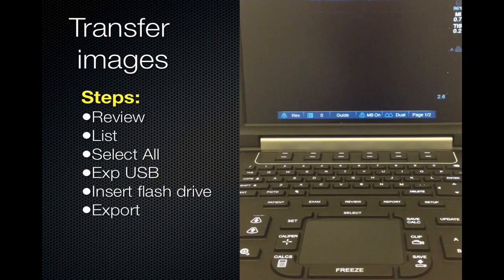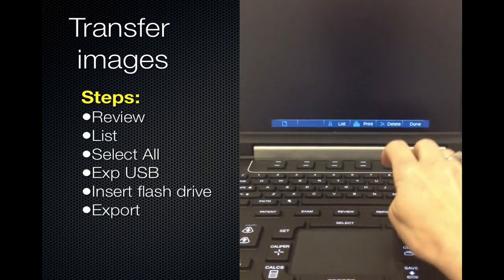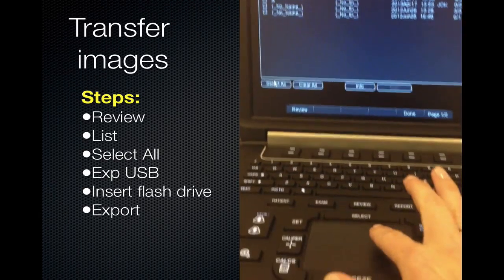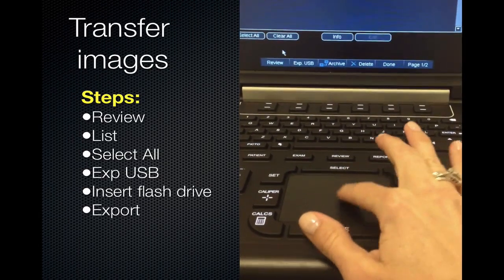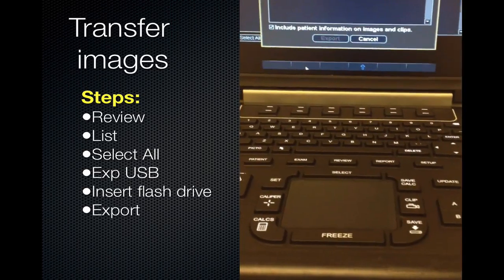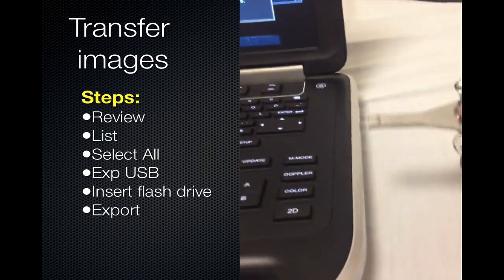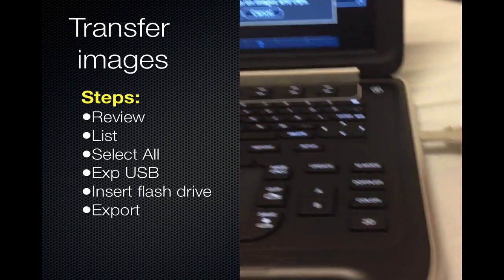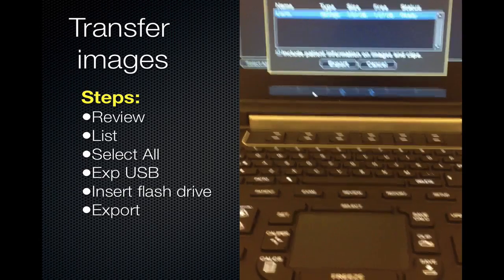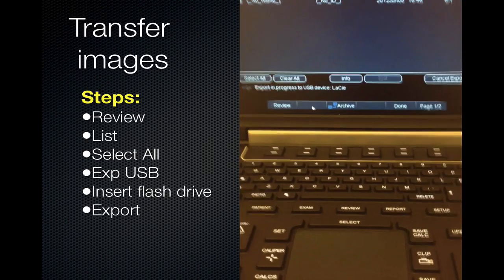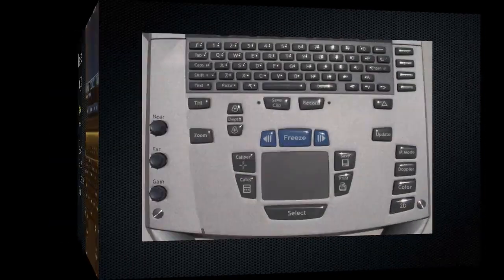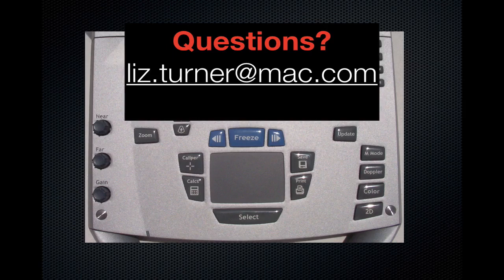Next, we will describe the transfer of saved images. Press Review, then List for a list of subjects. Use the trackpad to select one or all, and press the soft key representing Export to USB. Insert a flash drive, wait for it to show as an option, and then choose Export. If you have any questions about the general use of the Sonosite M-Turbo, please contact me and I will be happy to discuss them.